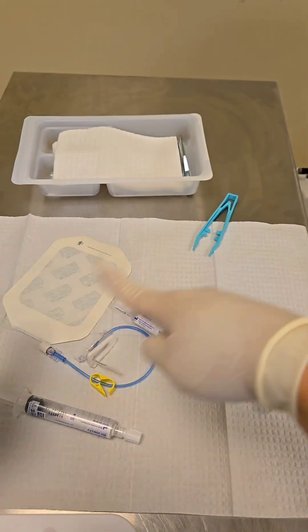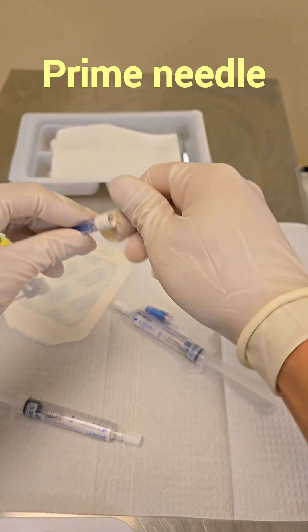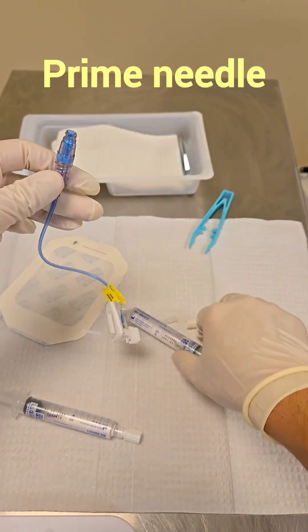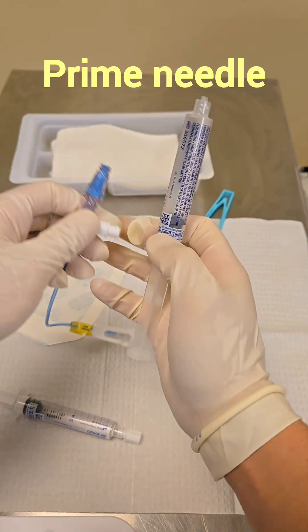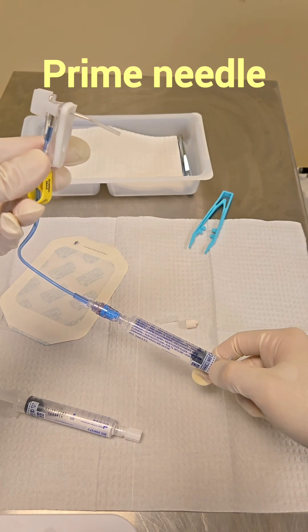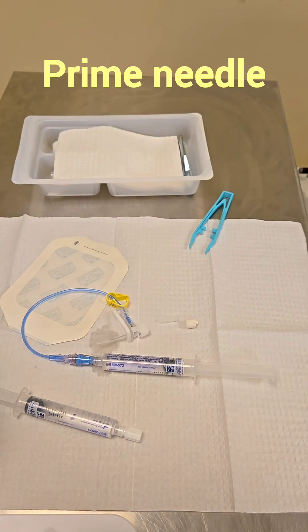Now that we have our sterile gloves on, let's set up our equipment. Starting with our portacath needle — do not remove the white part just yet. We're going to undo the back and attach our needleless connector first. Once the needleless connector is attached, we're going to flush the whole thing. Pull down to break the seal, slowly push up until you see a few drops — you only need about 0.3 cc until you see one or two drops. The line is now primed.